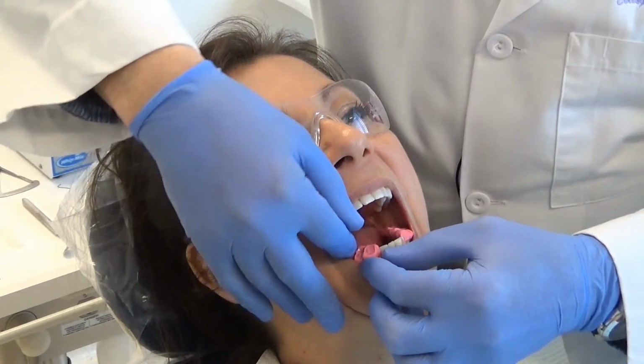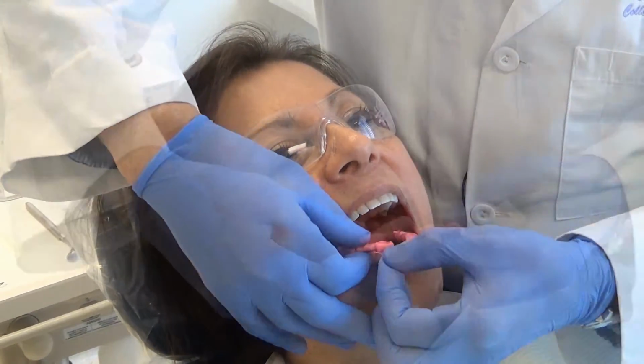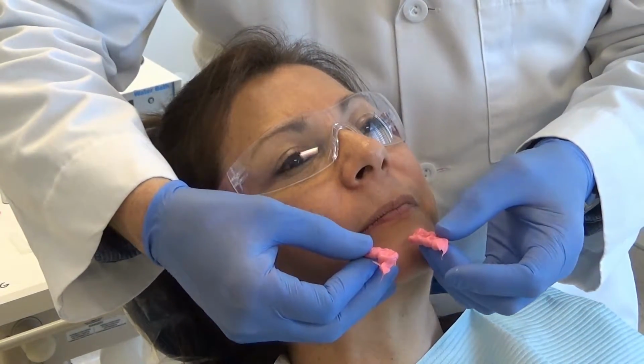Okay, so we waited about a minute, which is as long as it takes for this material to get hard. I'm just going to check it with my finger. It's nice and hard. Go ahead and open. And then I'm going to go ahead and remove my bite registration left and right.